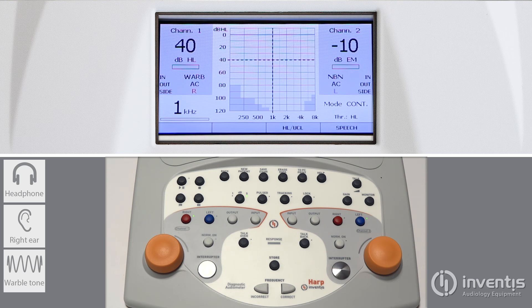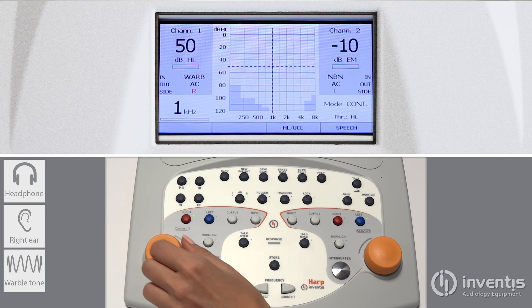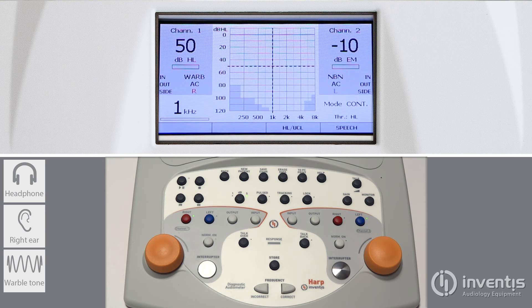Intensity level can be modified by rotating the knob. Increasing the masking intensity from minus 10 dB will automatically turn the channel on.